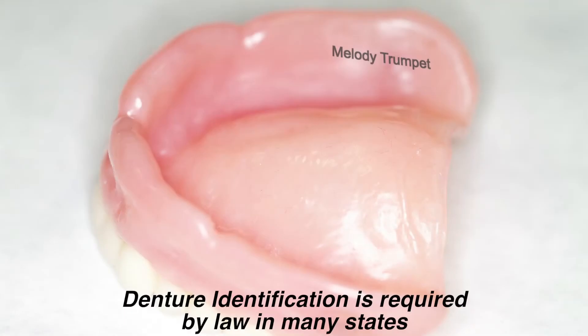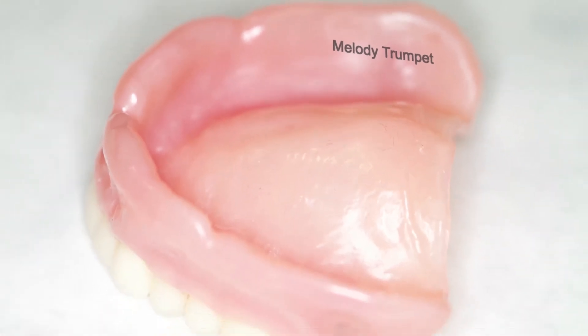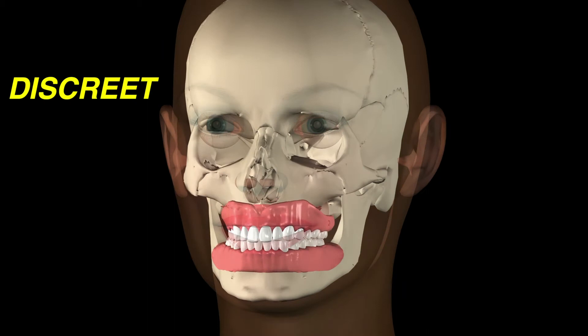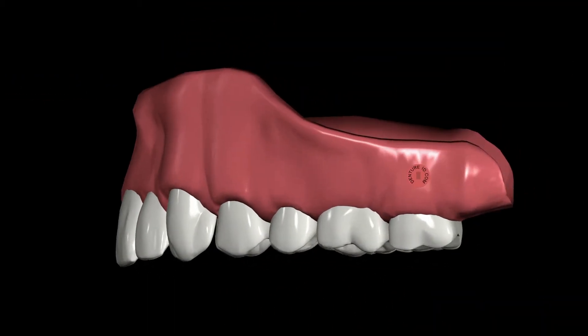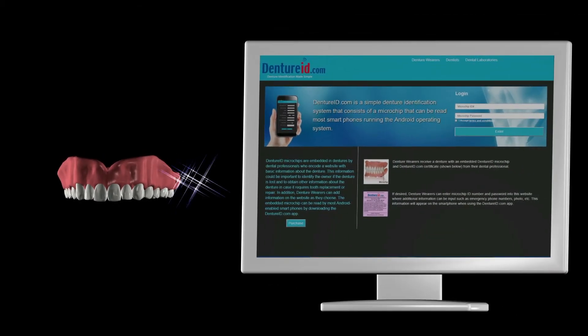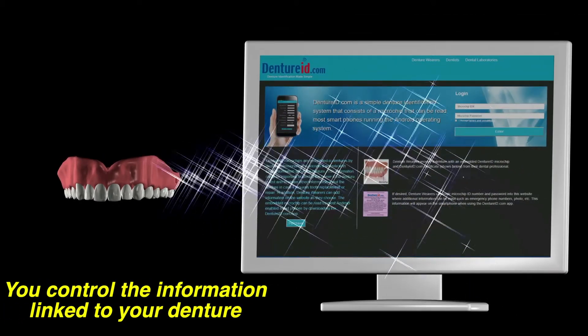In many areas, government regulations require your name to be permanently embedded in your denture. This is required because dentures are frequently lost. DentureID.com complies with most of these regulations by discreetly using a microchip instead of your visible name. The microchip is permanently embedded into your denture and is a digital link to your secure contact information and information about your denture that you control on the DentureID.com website.